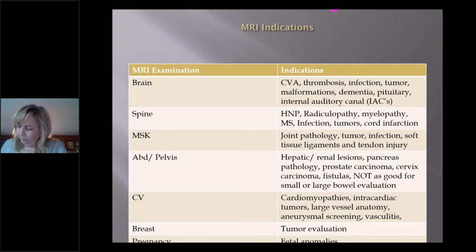Again, not real good with small bowel, large bowel, because it's collapsed. So if you're thinking more of a diverticulitis type scenario, or even colonic tumor, CT with oral contrast and/or endoscopy, colonoscopy really is the best answer. But if you're working it up from a radiological perspective, CT with oral contrast is going to be the better choice from a colonic standpoint.